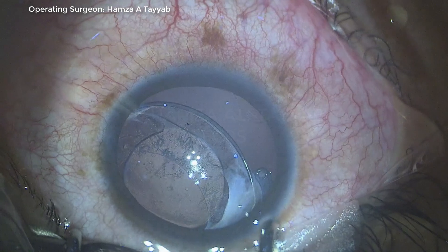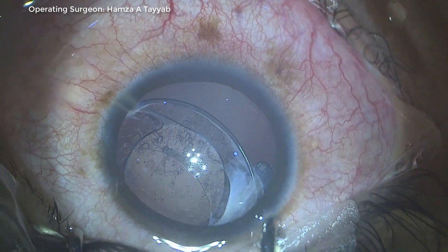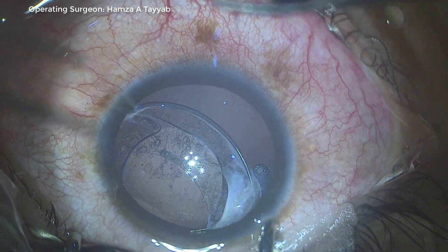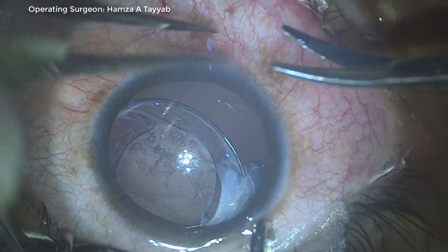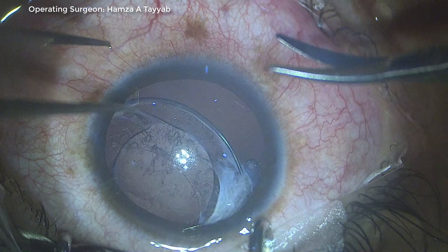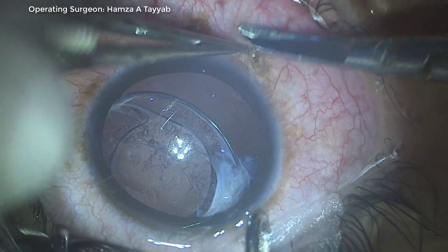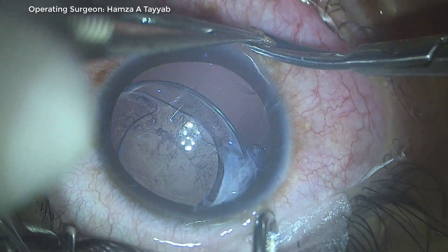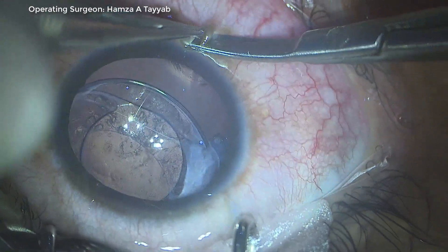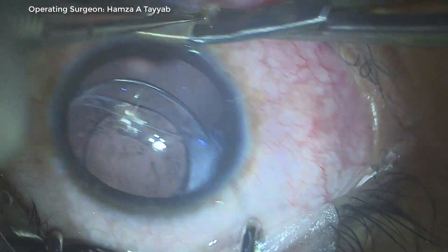Assalamu alaikum. Today I'm going to discuss a case of a CTR adjustment. This patient came to me with a dislocated IOL with CTR and dislocated bag. I decided to fixate the CTR to the sclera inferiorly, as the patient had been rendered partially aphacic due to the subluxated lens.